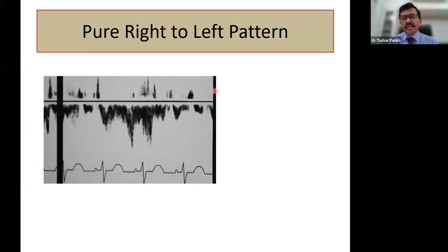Now somebody will say tricuspid atresia is also a right answer, but tricuspid atresia has many other things. For the baby to survive, there have to be other parameters, and the left atrium is also seen big there. So unless proven otherwise, if you have a pure right to left shunt at the interatrial septum level, then it is TAPVC.